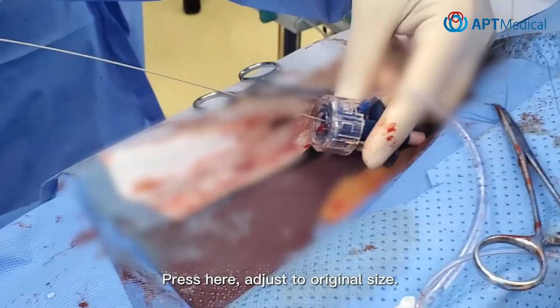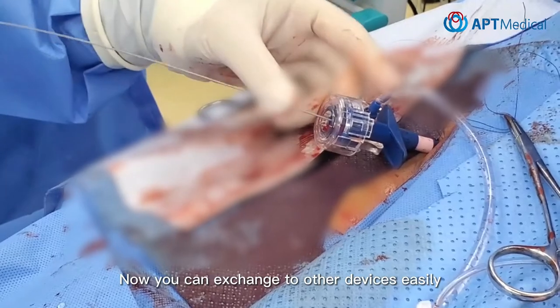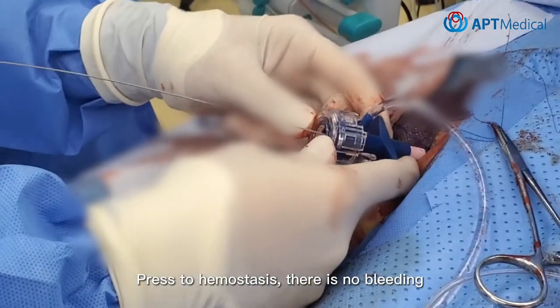Press here to adjust to original size. Now you can exchange to other devices easily. Press to hemostasis — there is no bleeding.